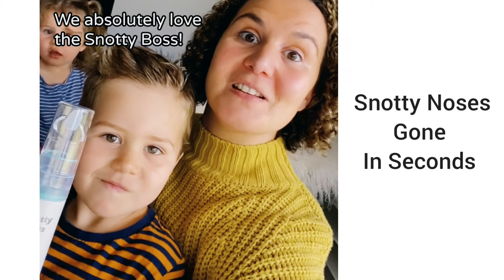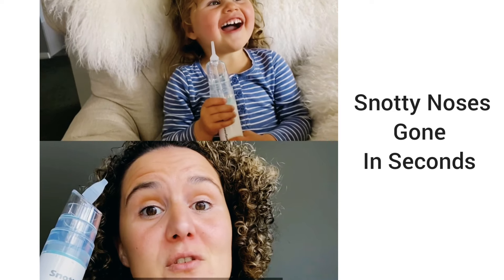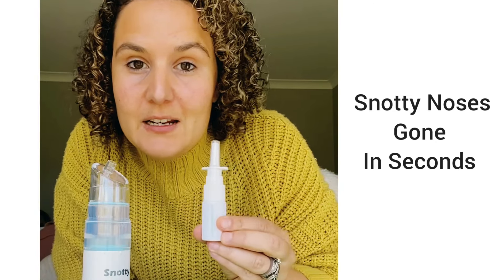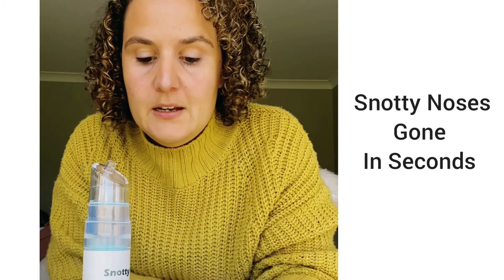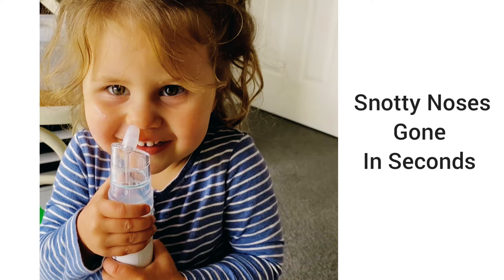We absolutely love the Snotty Boss. It has a strong, quiet motor that removes nasal mucus without feeling uncomfortable. You spray some saline up each nostril and then insert the nozzle to seal it and then suction out the gunk.